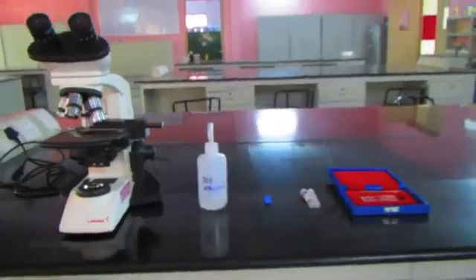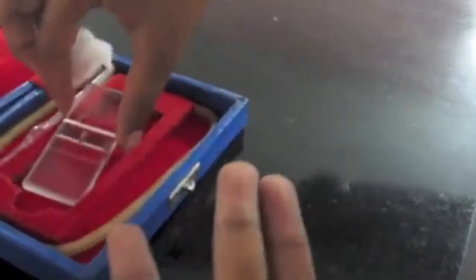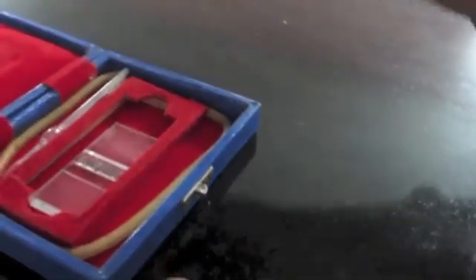Methodology. The materials needed for the experimental procedure are placed on the working table. Hemocytometer is taken and wiped using 70% ethanol. For collection of blood, first the finger from which the blood is to be collected is sterilized using 70% ethanol and pricked using a pricking needle.